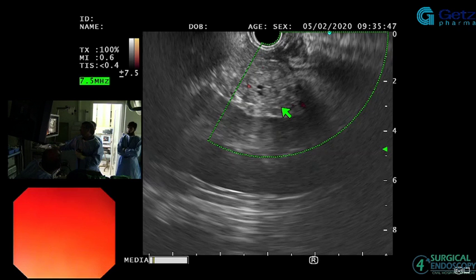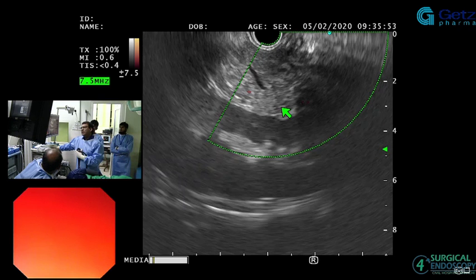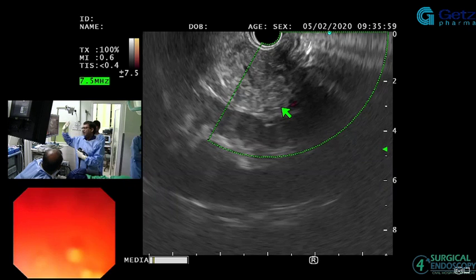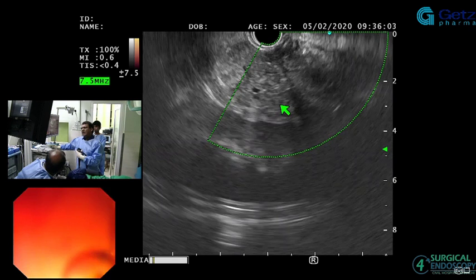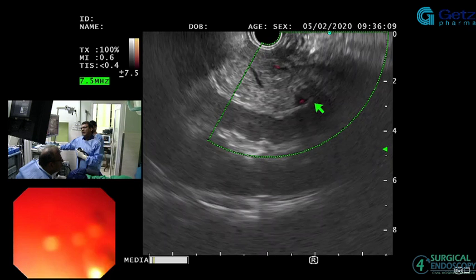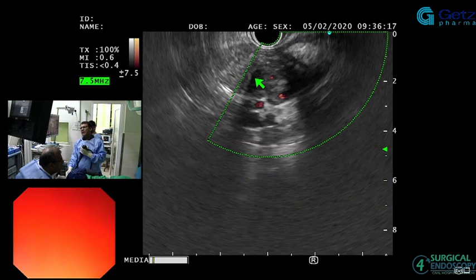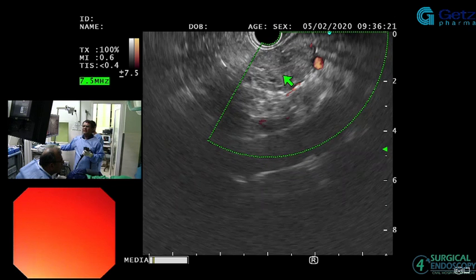When the scope is in the right position, I'm just standing really on one leg and just relaxing, and my hand is really on that keyboard, no problem. I can show you all that, the left kidney there, pancreas there, there's a spleen there. I'm rotating the scope. I get to that area where that fluid collection is, just move the scope in a little bit to get to the rest of the pancreas, get relaxing again in position, and everything is in the right place, and you see the whole duct here going all the way to the neck of the pancreas.